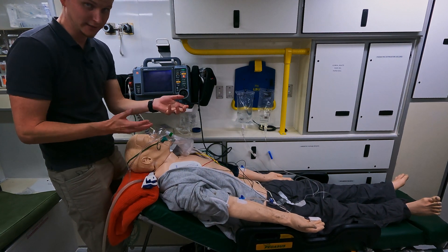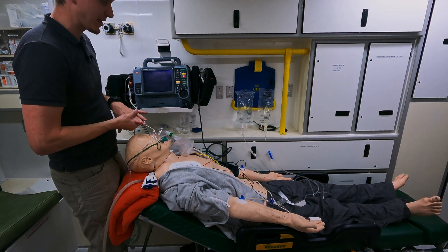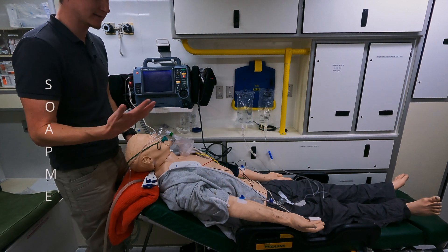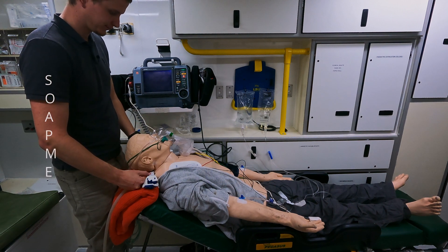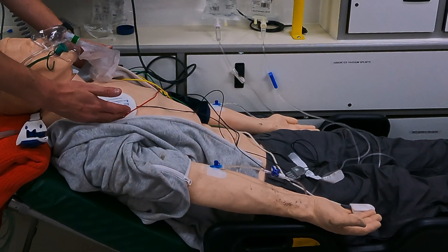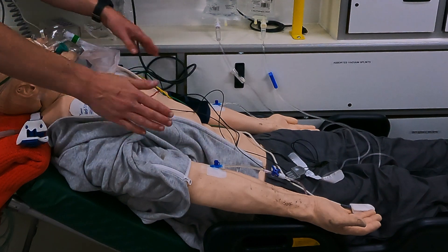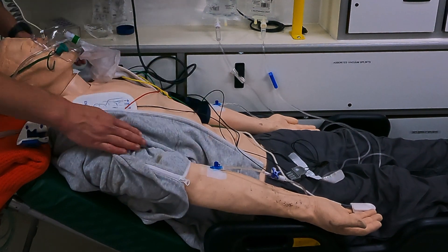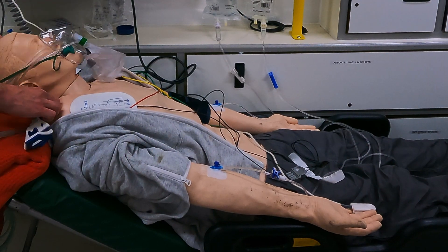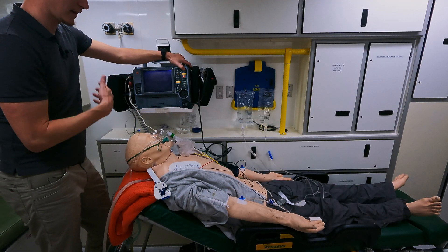This position will make intubation much easier. We're also prepared with all our equipment. We have our pads on, ECG on, BP cuff on the opposite hand to the SATS probe, bilateral lines in, and our tube tie already underneath the patient's head ready to go. So that is our positioning and preparation.